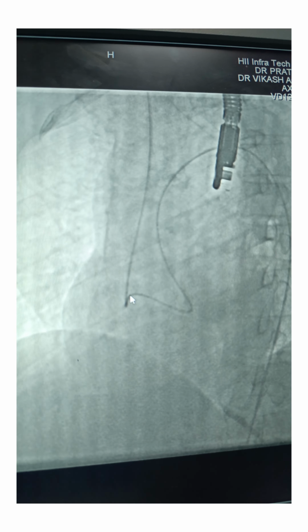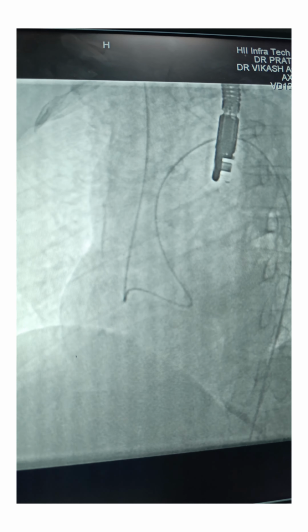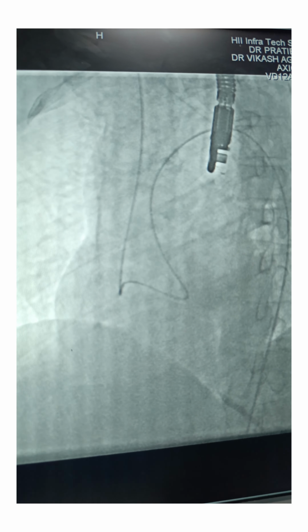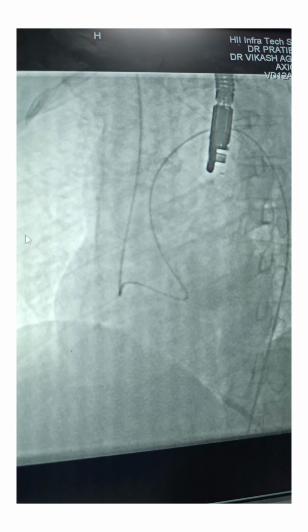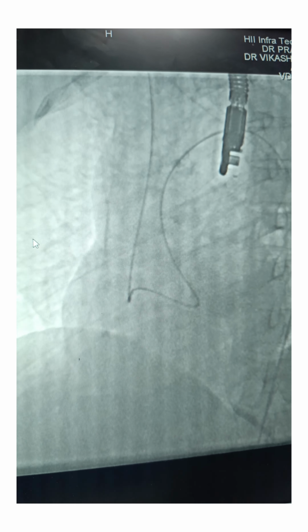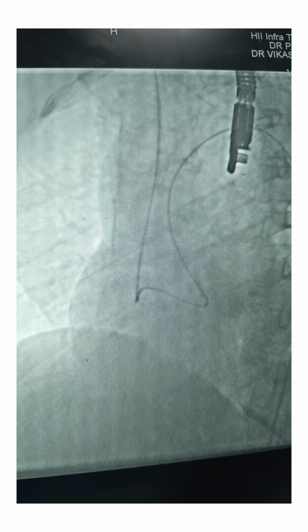I thought the pushing sheath would be very difficult. So again you punctured the right internal jugular vein? Yeah. And from there you have taken out the previous wire through that side. No, I didn't puncture again. I had the plans of using both sides, so the accesses were taken before the case was started. So now you are planning to put the sheath from the right internal jugular vein. Okay.